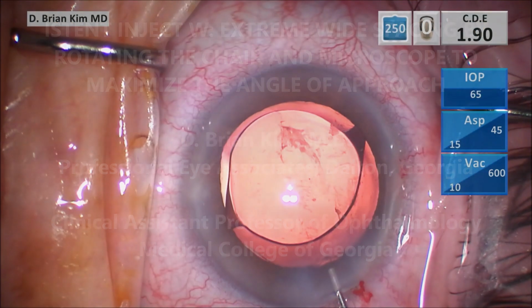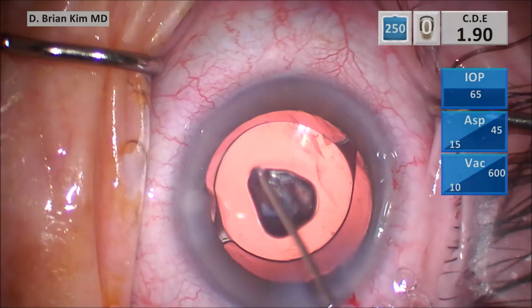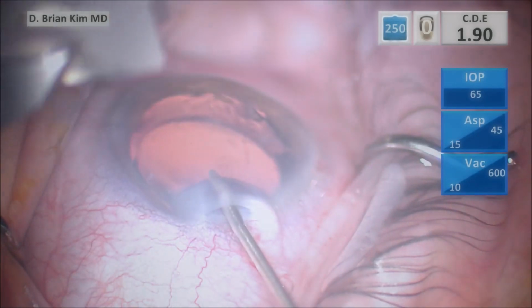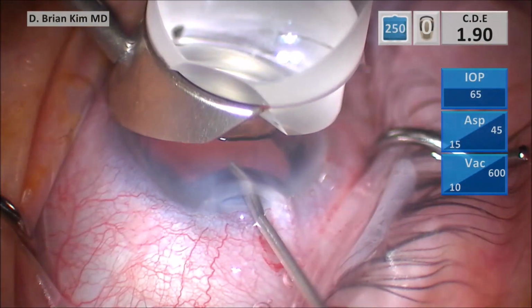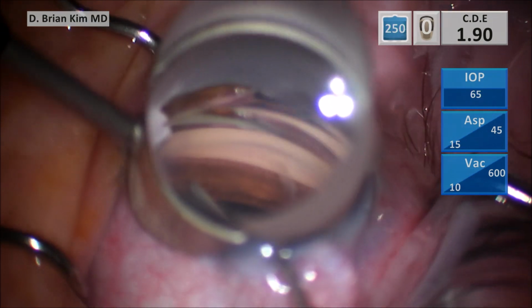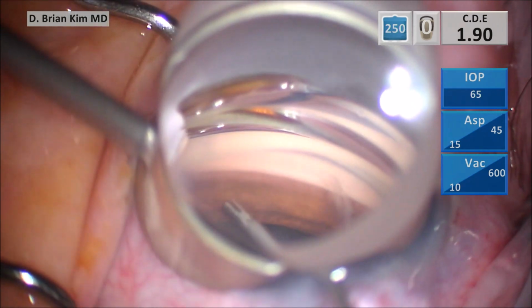As you can see, this patient's already had cataract surgery, and I'm injecting some cohesive viscoelastic into the anterior chamber and then on the cornea. I've turned the microscope away from me, and now I'm placing the gonio lens on the eye. I have the sleeve pushed down when I went into the eye. I'm going to retract the sleeve of the iStent inject W.